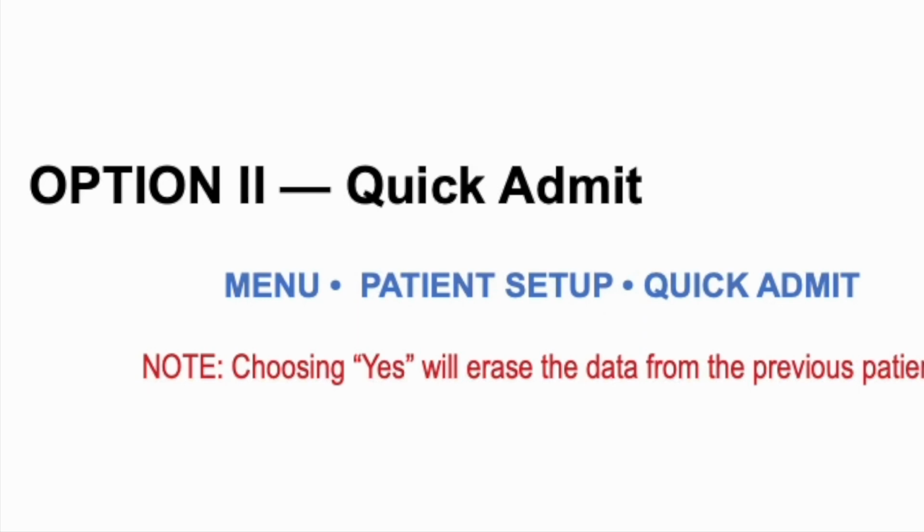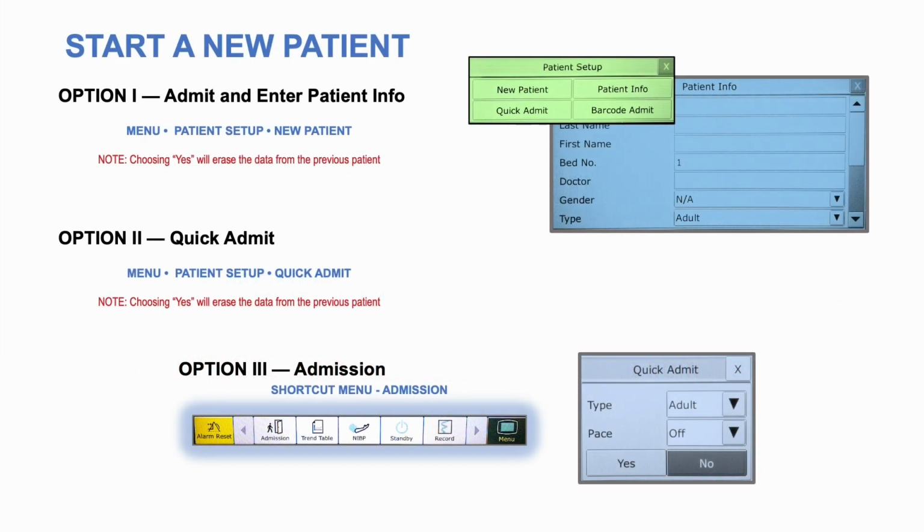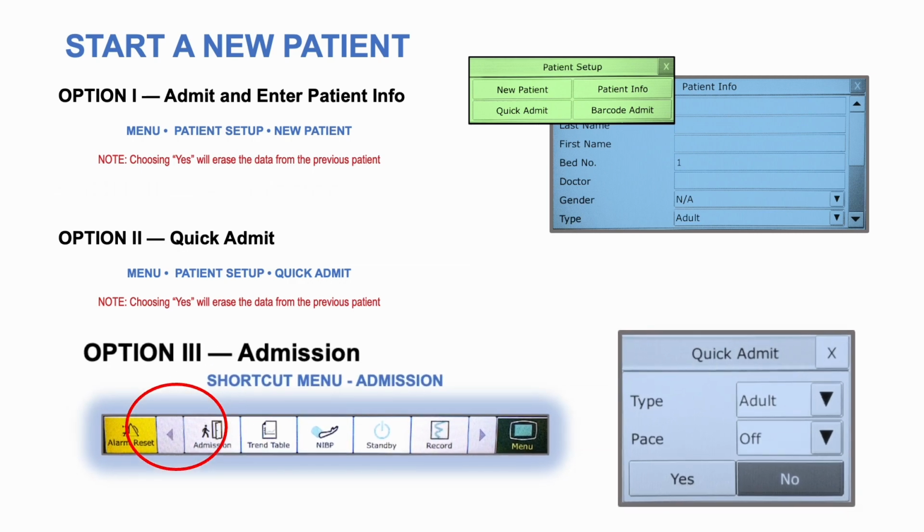The second option is Quick Admit. Press or touch Menu, touch Patient Setup, touch Quick Admit. A prompt will appear indicating that the data will be erased from the previous patient if Yes is selected. The third option is the most direct.